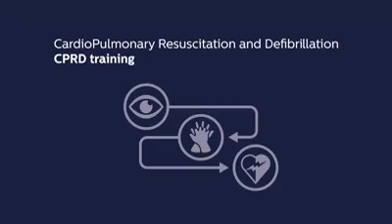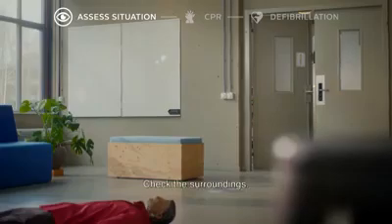Cardiopulmonary Resuscitation and Defibrillation, CPRD training.